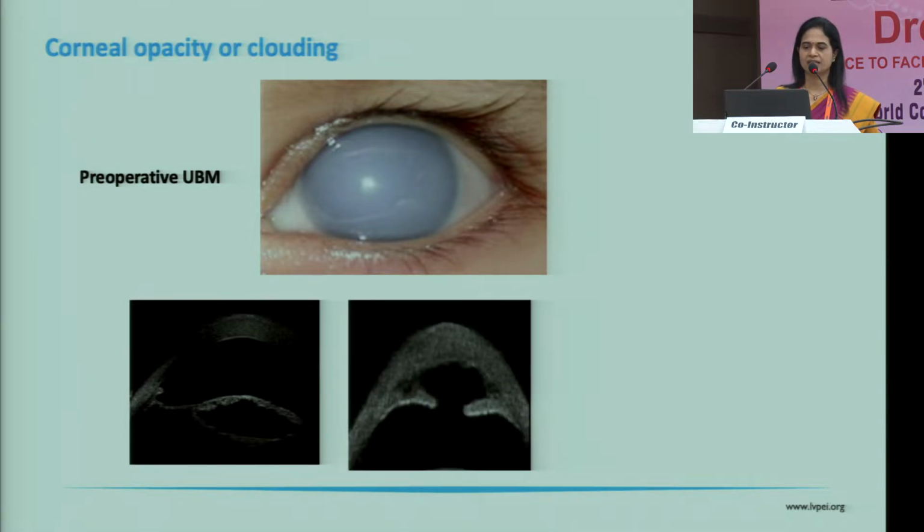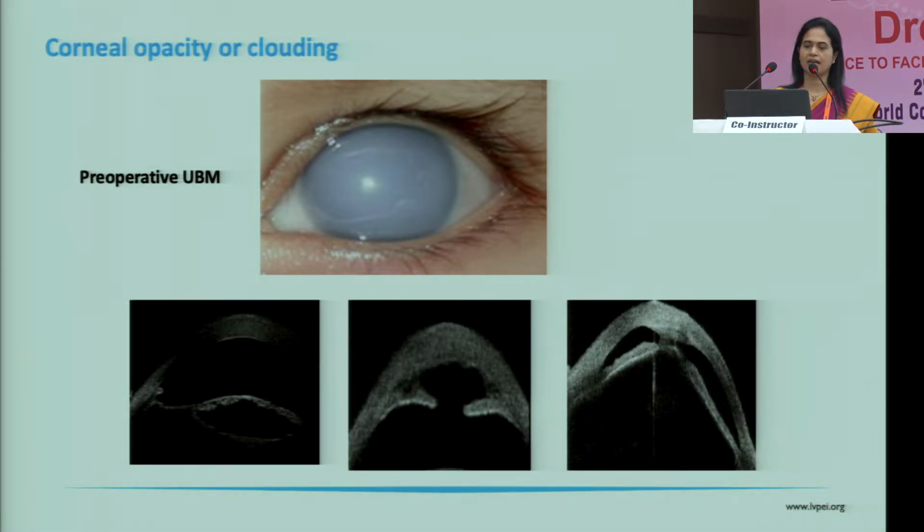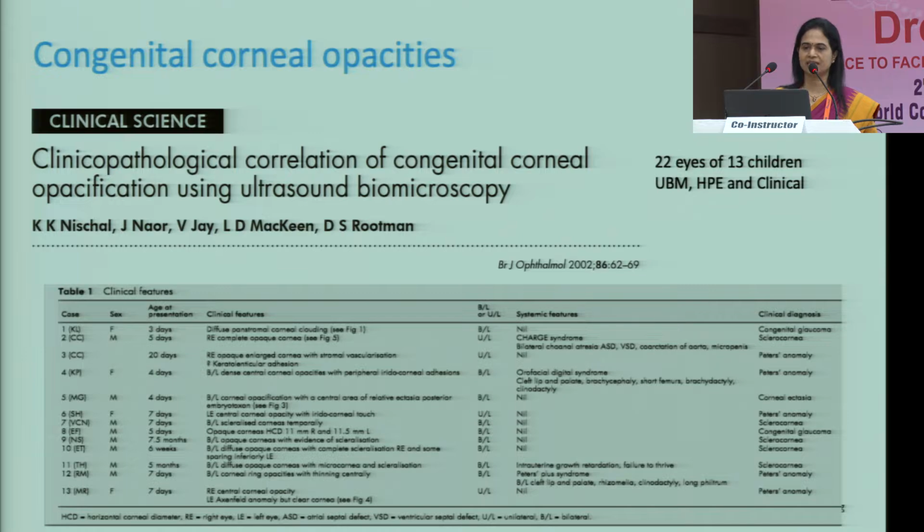Is this aniridia? Is this an iridocorneal adhesion? Is this something else?